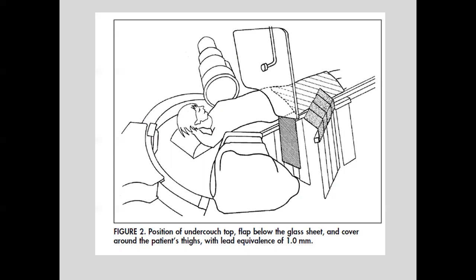So we're using the worst possible angle for staff radiation. So that's why this is a very important shield to me. That's why I'll always put it in, okay? And they also recommend using the rad pads. If you've seen rad pads, you know what rad pads are, they definitely will reduce your dose.